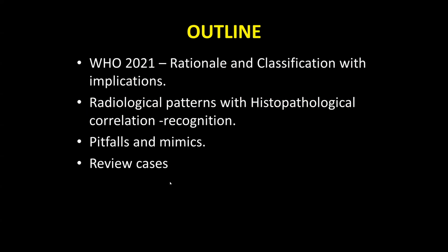Right. So the outline of the seminar is like that. I have prepared this keeping in mind the WHO 2021 revision of lung tumors. So we will be looking at the radiological pattern, and the histopathological and the molecular basis is very important to be able to understand the radiological pattern. Therefore, we will go through them in little detail. Then we'll quickly look at the pitfalls and mimics, which most of us are aware of, but we tend to ignore this diagnosis for some particular patterns, and we will look at 3 review cases where you can try and apply all that you have learned.